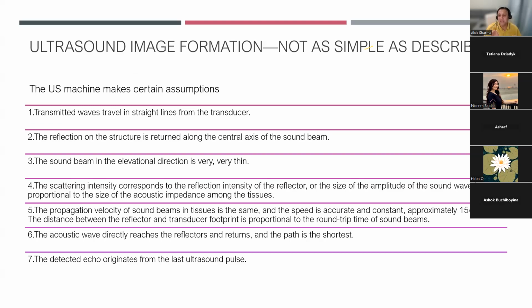I can't emphasize enough how, with all forms of ultrasound imaging, whether that's the brain, if you put a probe over the skull as opposed to the anterior fontanelle, good luck, you're not going to get good images. Similarly, if you put an ultrasound probe over a rib, and you don't get good penetration of sound waves between the rib spaces, you're not going to get very good images. That is going to be because of reflection, because of scattering of the sound waves even before they actually enter the lung.